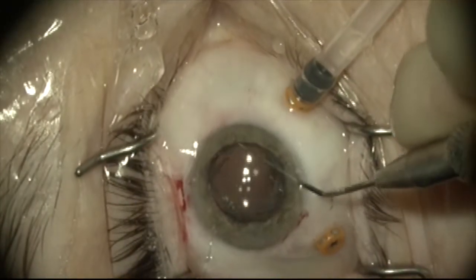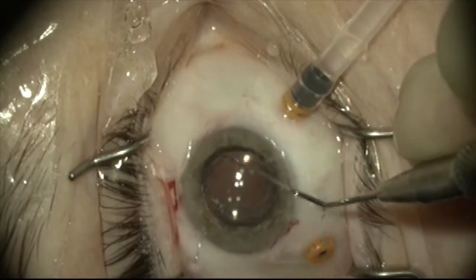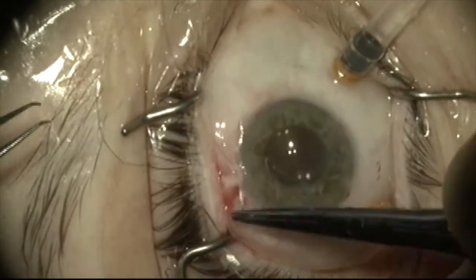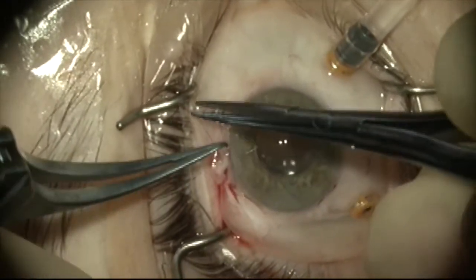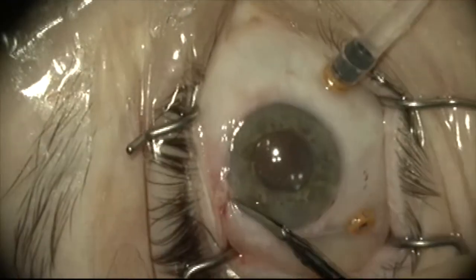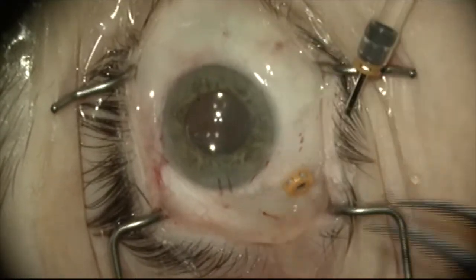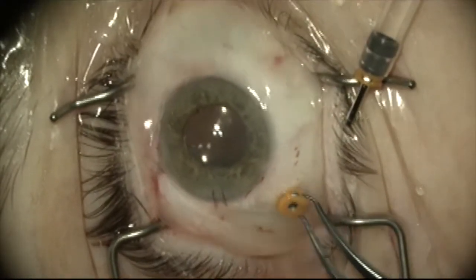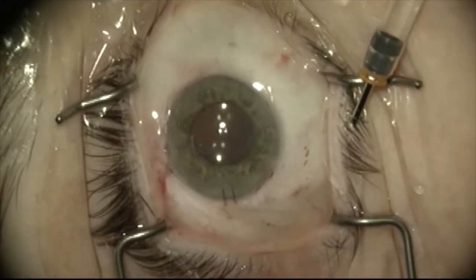Once this is cut short, I'm going to test the position and stability of the lens, which is excellent here. The conjunctiva is closed. The trocars are removed. This patient did quite well with 20/20 vision the next day with a low myopic correction of minus 0.75 diopters.